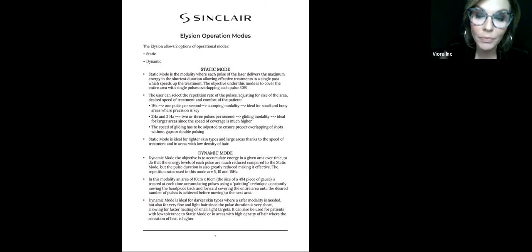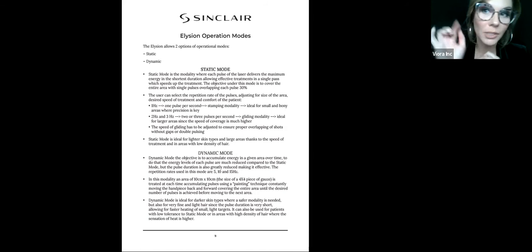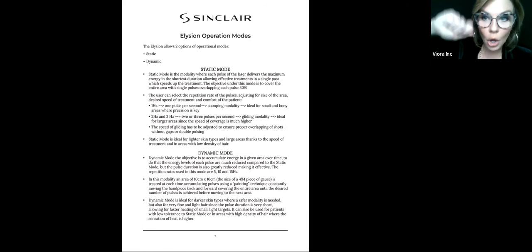So there's the timer. We have amazing cheat sheets where all you have to do is read the sheet, plug in the numbers for the skin type, hair color, and hair thickness, and it tells you what to do. You put in how many pulses you want and how much energy, and it gives you the time you need in whatever hertz you have chosen. For example, let's say it says 9 joules. I set it to 9 joules, and then I want to do 15 hertz. I choose 15, and it tells me to do 400 pulses, so I set it to 400 pulses. Let's say it tells me 40 seconds, so it times it out for you. As soon as you start in that one square, all you do is go back and forth somewhat quickly.